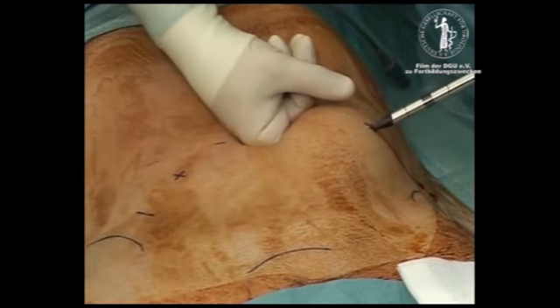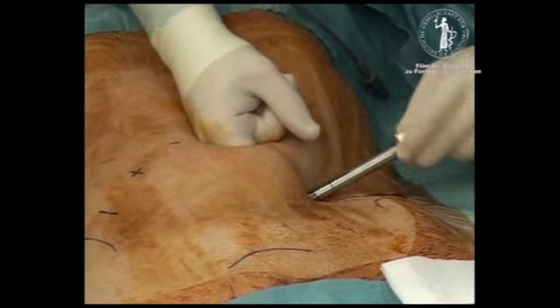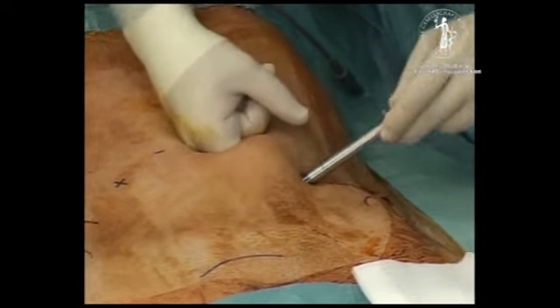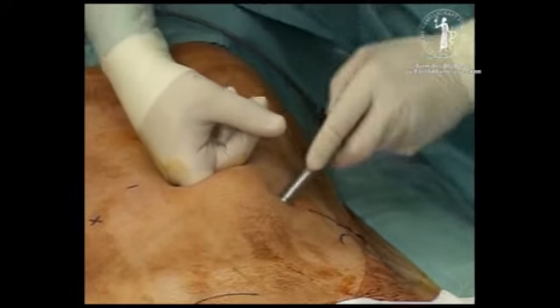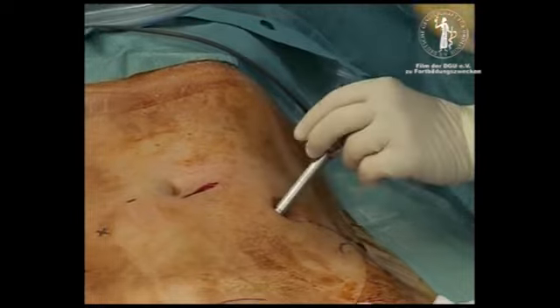The first 8 mm robotic trocar is introduced with a blunt obturator on the left side between the subumbilical incision and the left anterior iliac crest, about 1 cm lower than the camera trocar incision.